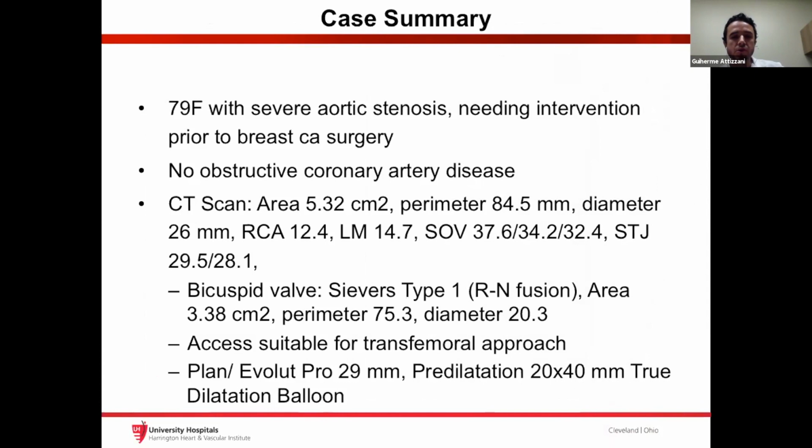I usually choose based on the minimum diameter that is going to interact with the balloon. It can be from the raphe to the opposite side. So that's based on the minimum diameter, whatever interaction the balloon is going to have along the way. I base it on that, basically.